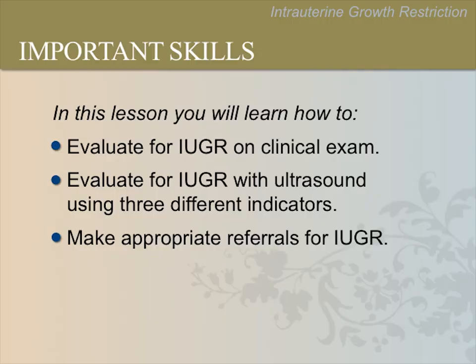There are 3 main skills you will learn in this lesson. You will learn how to evaluate for intrauterine growth restriction, or IUGR, on clinical exam, evaluate for IUGR with ultrasound using 3 different indicators, and make appropriate referrals for IUGR.